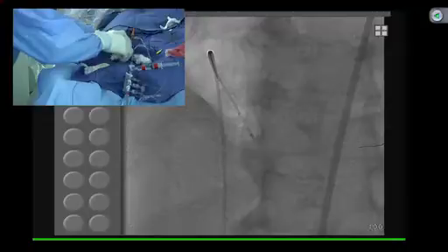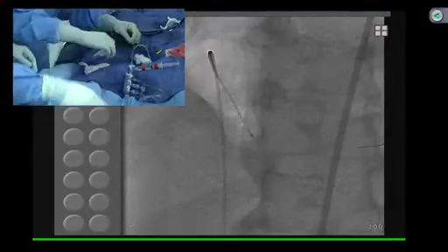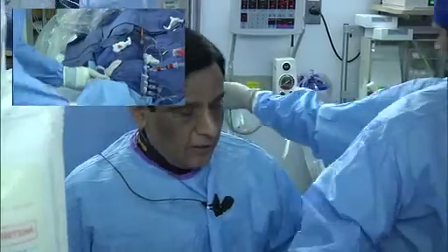Another quick question which has come: if you had a drug coated balloon, would you use it here? Yeah, I would say it makes sense. It definitely makes perfect sense based on the available data, but the problem is if you are comparing it against balloon angioplasty. The question is regular balloon versus drug coated balloon. Yes, drug coated balloon will win, but will the drug coated balloon be better than another drug-eluting stent? That still needs to be seen, and there is no clear-cut answer on that point.